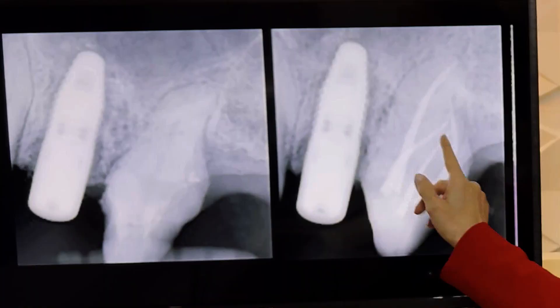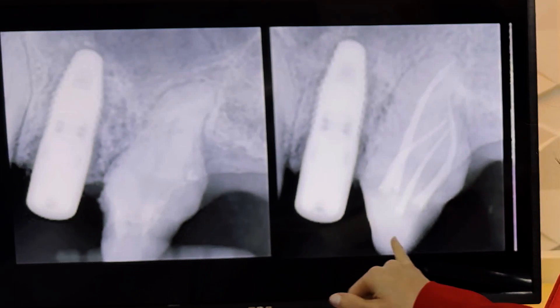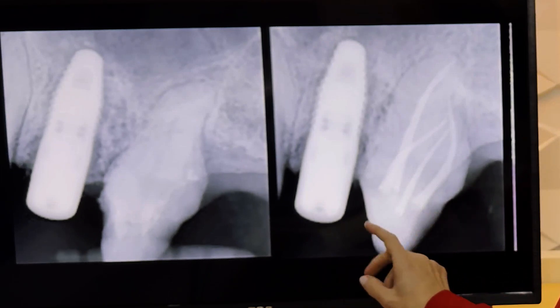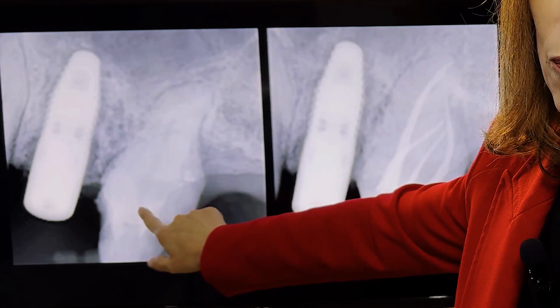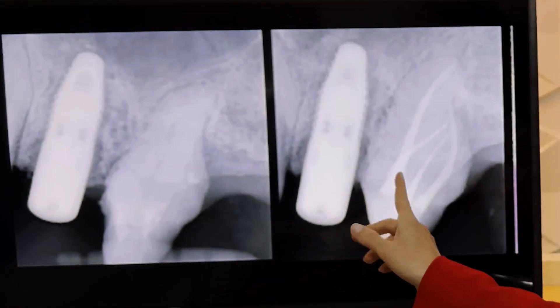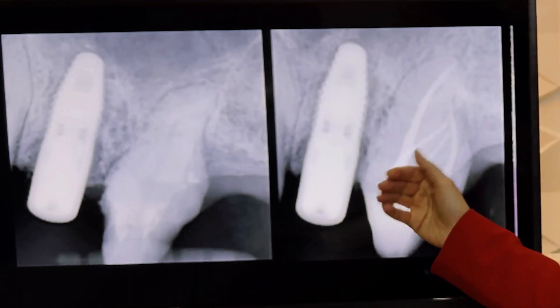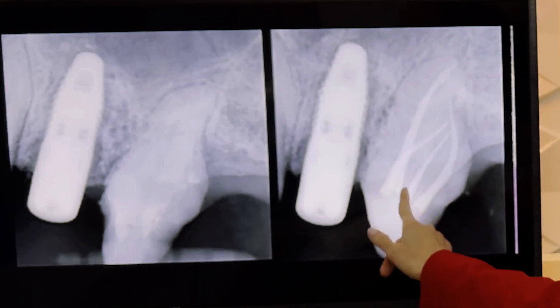This is the end result. As you can see, there are four canals in this tooth. The tooth is now ready to have a crown. I don't love the core build-up — the lines are not too parallel and it's not retentive enough. But if you look at the pre-op x-ray, there is enough coronal tooth structure for the composite. So when the dentist proceeds with the crown, they are going to re-prep that tooth and adjust the core so it's more parallel.